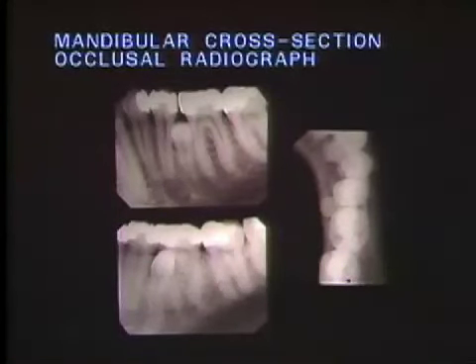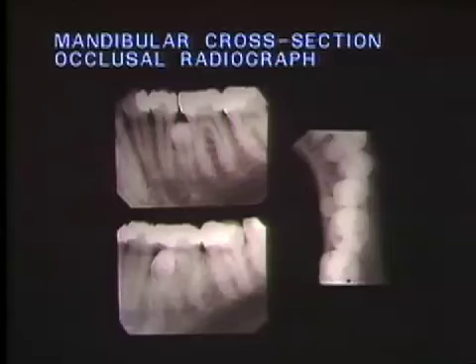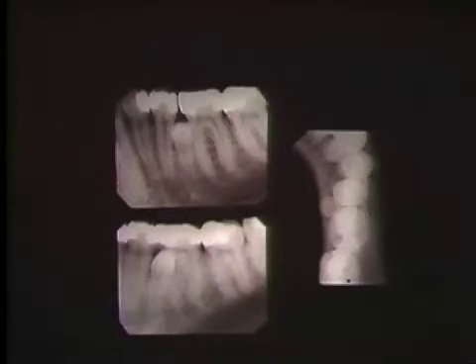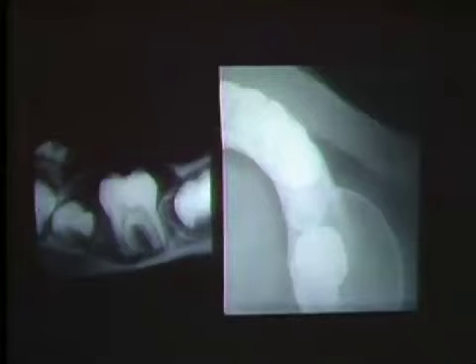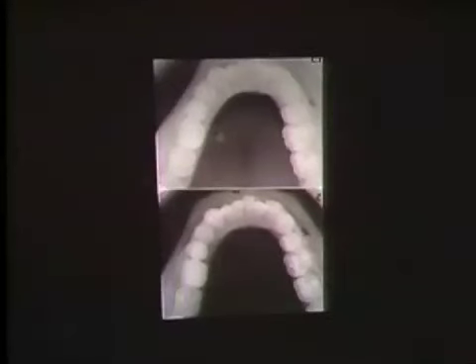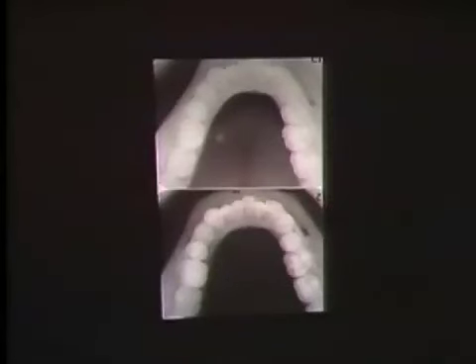The mandibular cross-section occlusal radiograph can be used to localize embedded objects in the mandible, to show the extent of expansion or perforation of the jaw, and to demonstrate lesions in the floor of the mouth. An ideal cross-section mandibular radiograph portrays the teeth in true cross-section. Both buccal and lingual cortical plates should be visualized.